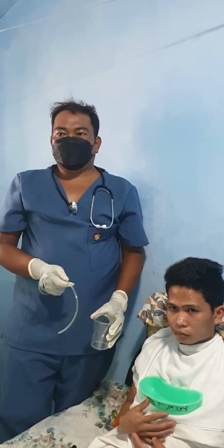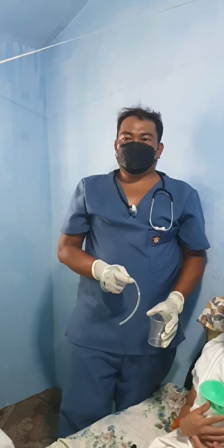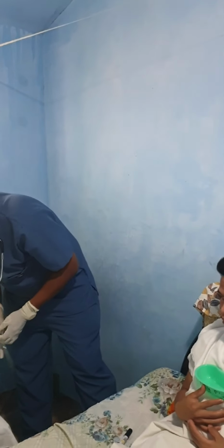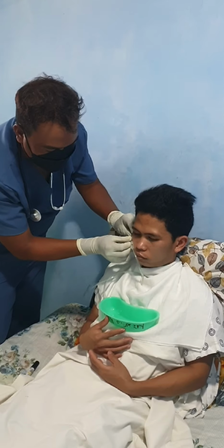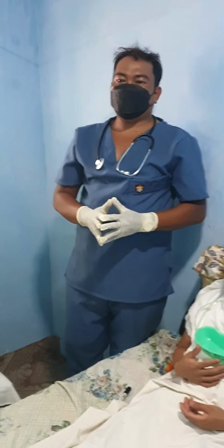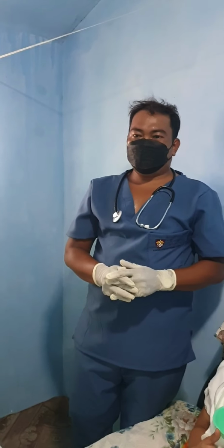Continue to advance the NGT until you reach the mark you have placed for measurement. This ensures accurate placement. Temporarily anchor the tube to the patient's nose or cheek with a piece of tape until you can check for correct placement. This prevents displacement of the NGT while checking placement. Verify the tube placement according to agency policy.